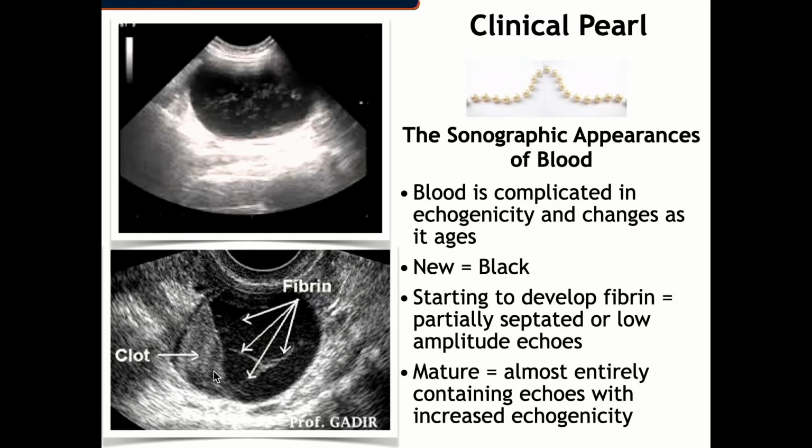And then finally, the blood will begin to resolve and very slowly decrease in size.